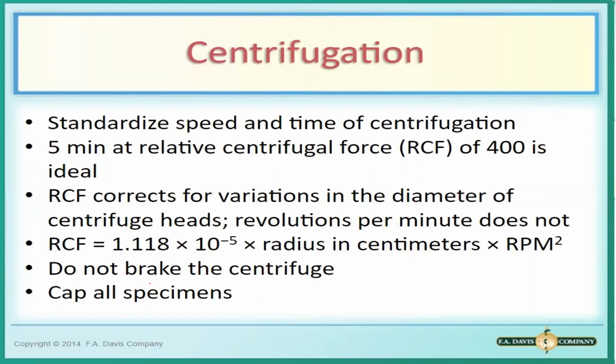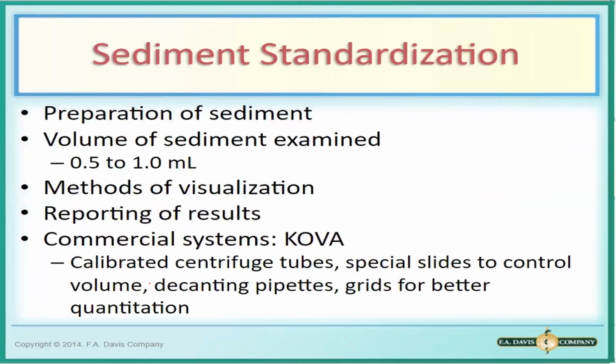Centrifugation. Centrifugation standard is 5 minutes at 400 RCF. Post-centrifuge sediment naman, 0.5 to 1 ml. This is after the decantation.